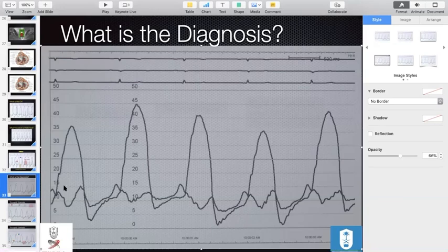And then you go look at the pressure tracing. You have two pressure tracings. Again, look at the scale here. Very likely this is the right side of the chambers because it's a low pressure system. You can see here in this pressure waveform, try to pick the diastole time. In diastole, it looks horizontal. Okay, so this must be atrial versus ventricular.